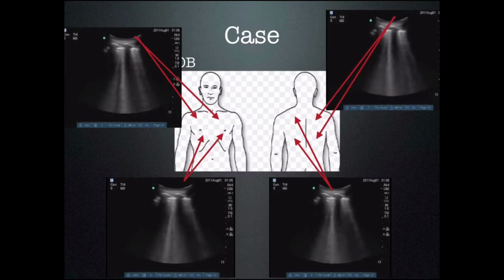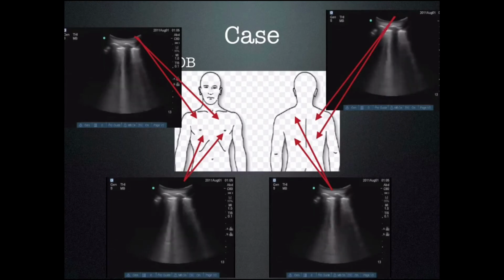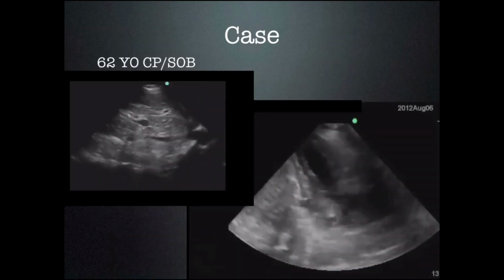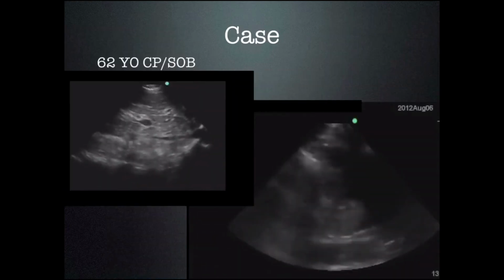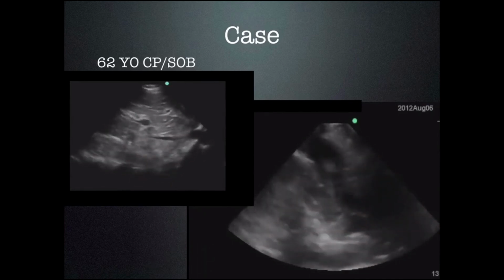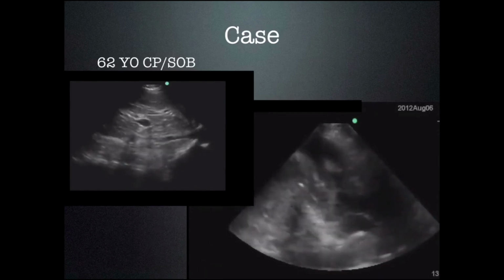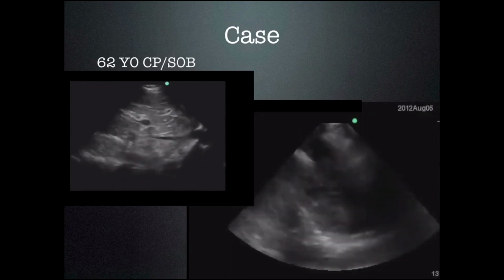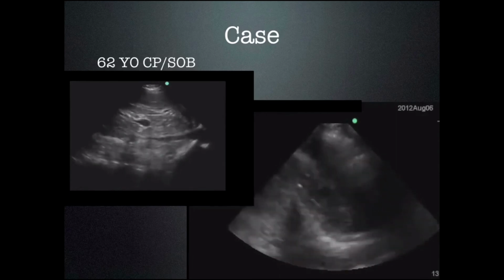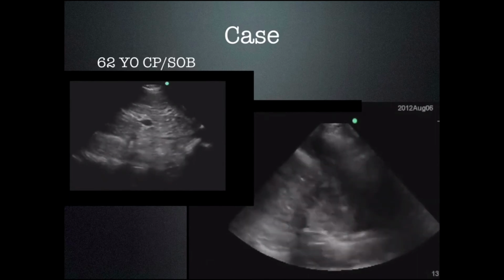And when we see it like this in a person that has HIV, we start to think, this is probably PCP or pneumocystis. So let's look at the IVC. It's very flat. That goes along with the diagnosis of pneumocystis. They're generally fairly sick by the time we see them in the emergency setting. We look at their EF. It is very high. Their heart is ejecting all the blood it can get out. So this patient is not only having a problem with their lungs and they have pneumocystis, they're also septic. So you need to treat both the sepsis and the pneumocystis.